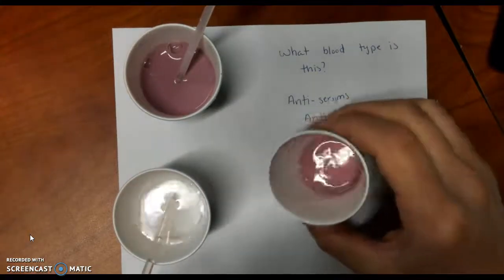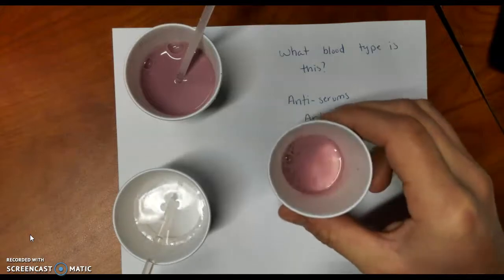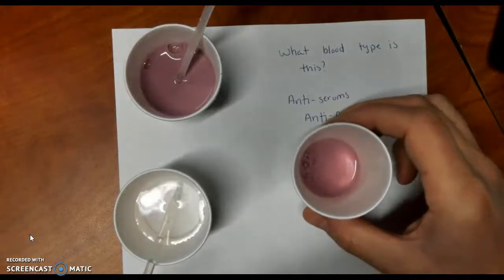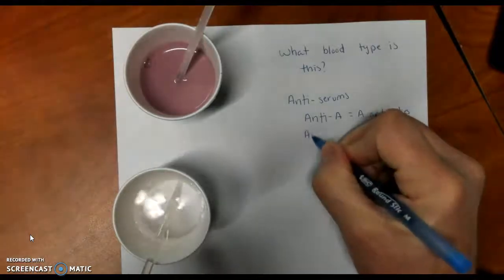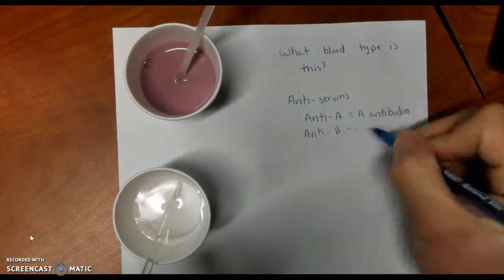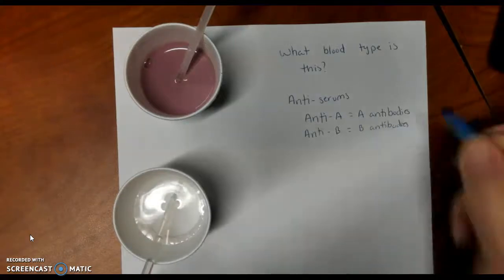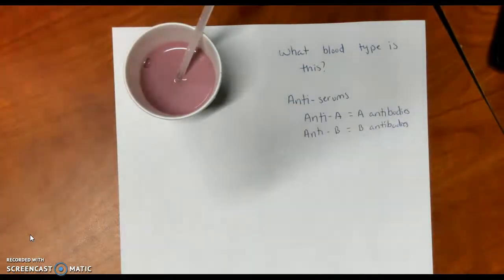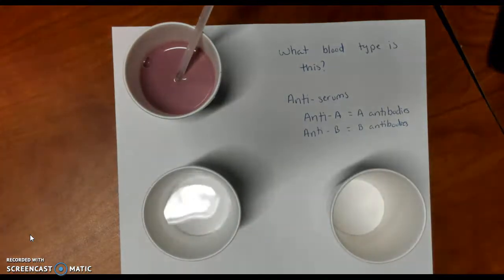So if I start to swirl this a little bit, I can start to see that our blood is starting to thicken up, which is clumping or agglutinating. I now know that this possibly is A or AB blood. Now, we have to test to see if there is the B antigen. The anti-B serum will have B antibodies. So let's set this blood sample to the side, get the A serum out of the way, and here's some B serum. Let's check that one out.